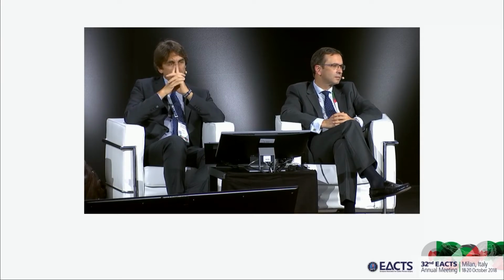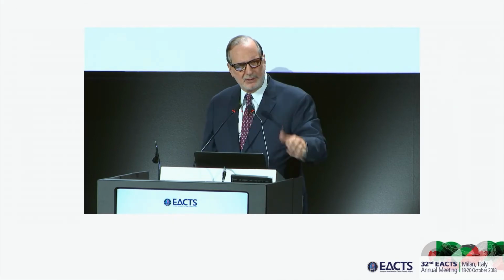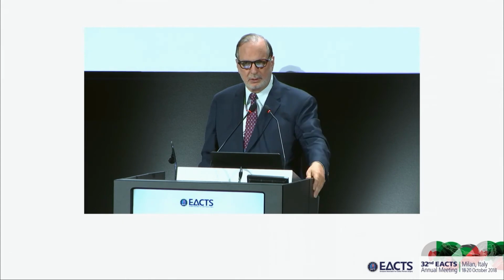And, you know, we're building our series right now. We'll eventually publish this, but I can just tell you that except for the first patient there, all those patients could be decalcified with CUSA and they would do fine. Yeah. You know, I've been more aggressive as I've done about 250 of these now. So I am getting a little bit more aggressive, although I want to tell the audience that you probably shouldn't start off doing a whole bunch of calcified bicuspid valves. So we are doing more decalcification, I must admit, and I know what your data is.